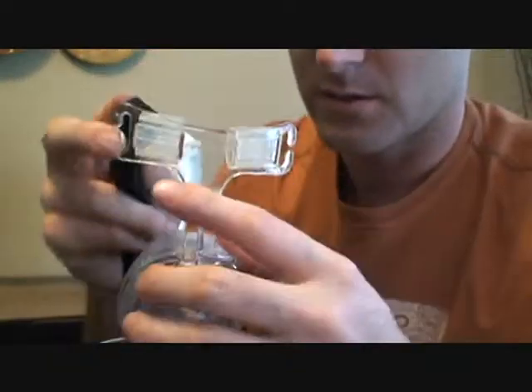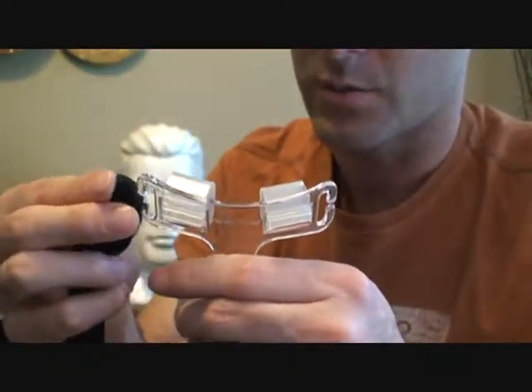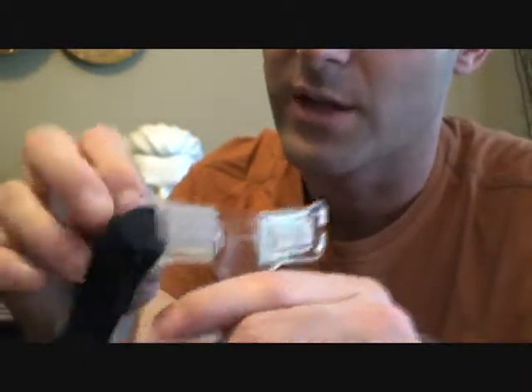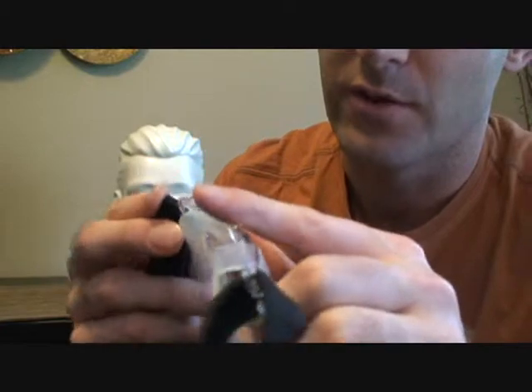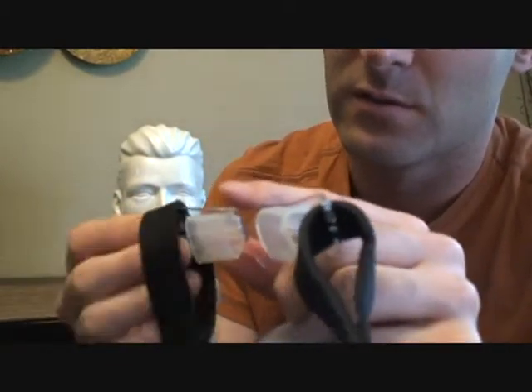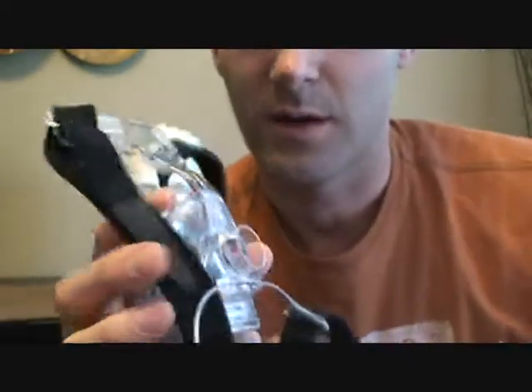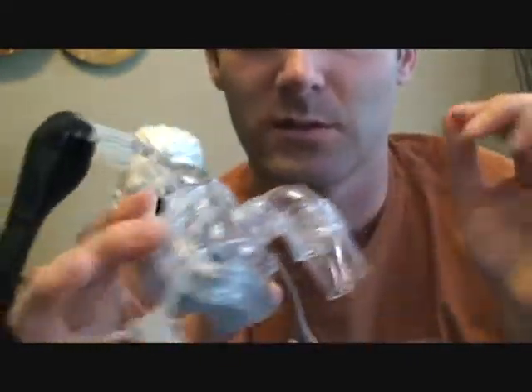The headgear slides right through here again, assuming you wash this separately or when you take it off. Fisher Paykel makes some of the thickest headgear also. It's pretty spongy, so it's kind of hard to get through these. It's nice when you're wearing it because it's very soft, but tougher to get through these grooves. Okay, there we go. And the last piece to get back on is this nozzle. All you do is push it back on until it clicks.